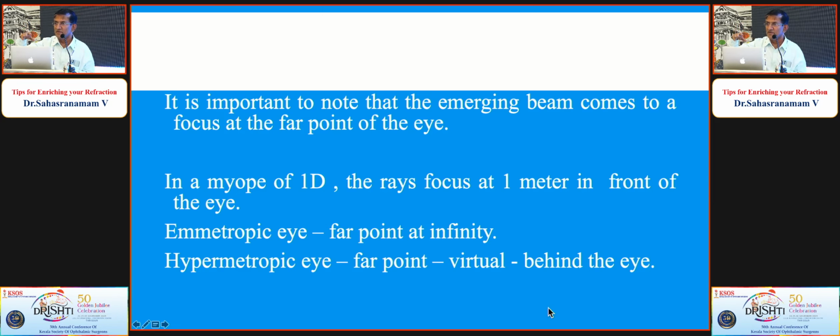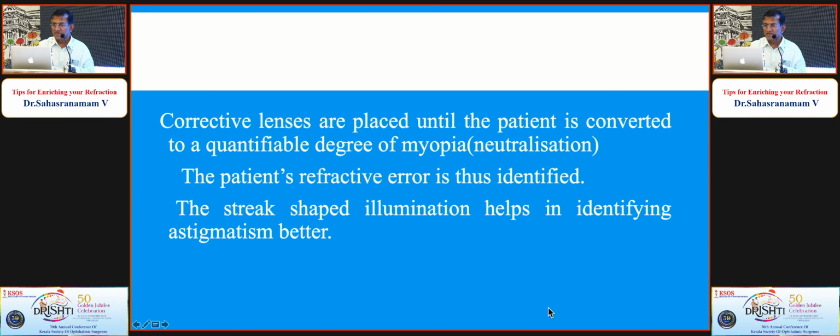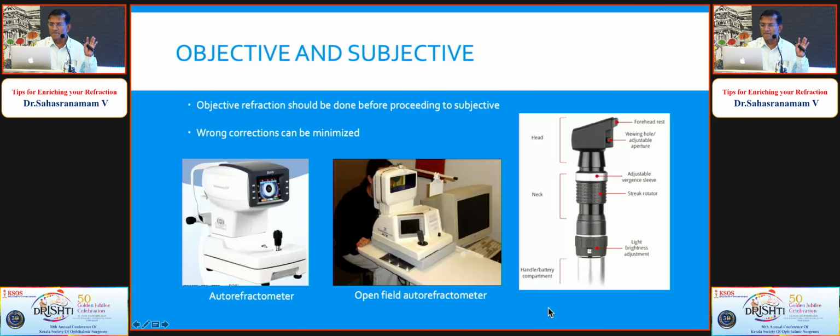Assuming that we are not considering whether we are putting in a cycloplegic or not. This is just for the distance correction, I mean, the working distance correction. If there is a strong cycloplegic, you make the cycloplegic correction as well. Okay, so that's the basics of that. This we have already told.